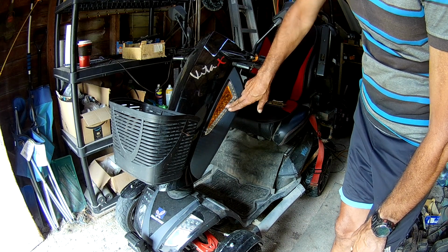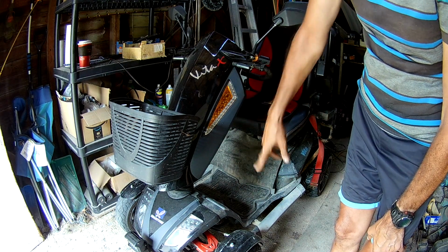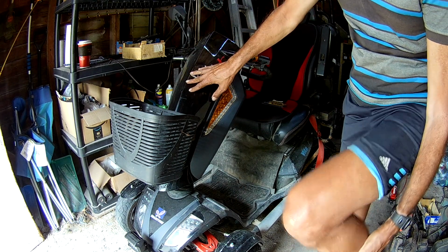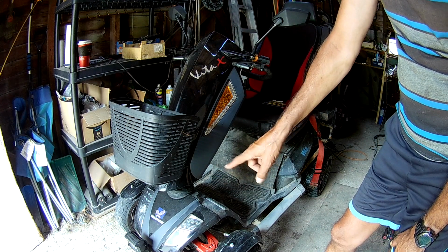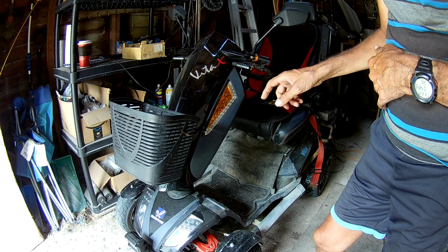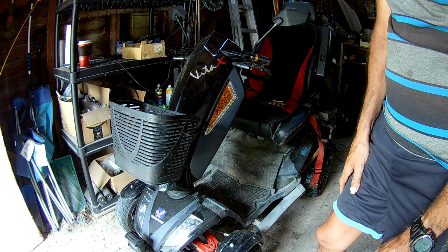Because instead of these being wired separately and those being wired, I'm wondering if these are both together on the same wiring. Because the lights for these come from underneath and should go straight up into here. And there's no weather issue with that. Everything inside, there's no corrosion, everything's dry. So I'm just wondering if they're on the same loop as those down there. If that's the case, then if I fix those plugs, that should fix the problem, right? That's what I'm thinking. That's what I'm hoping. So that's going to be my goal today.